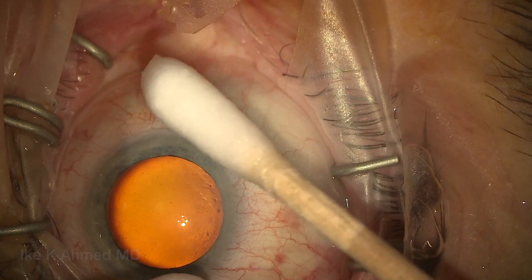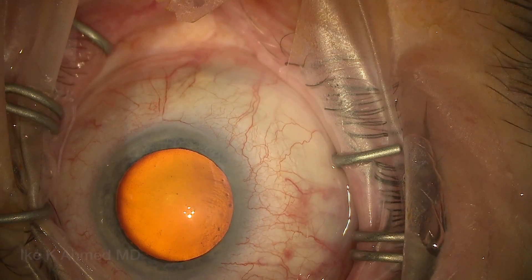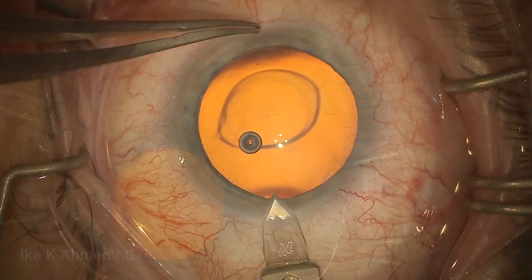Usually you wait about a minute or so prior to making incisions. Mitomycin binds fairly quickly, so there's really very little concern about entering the eye. Although we do irrigate the surface of the eye to ensure there's no free mitomycin that may have leaked onto the surface prior to making incisions.